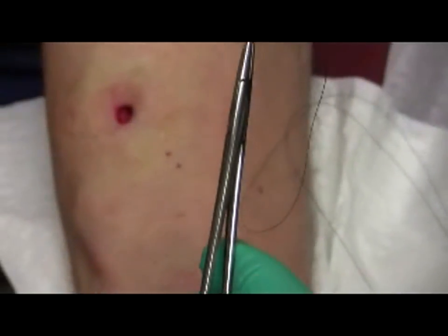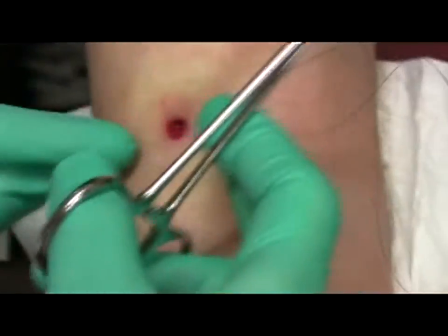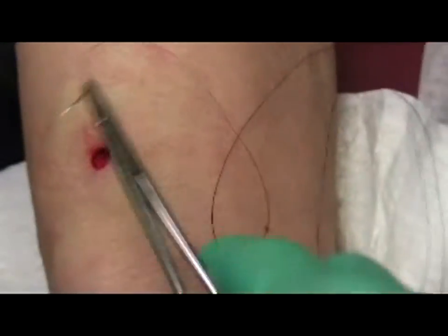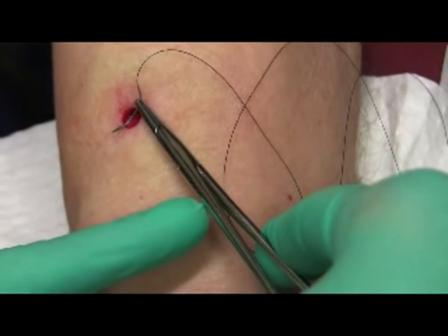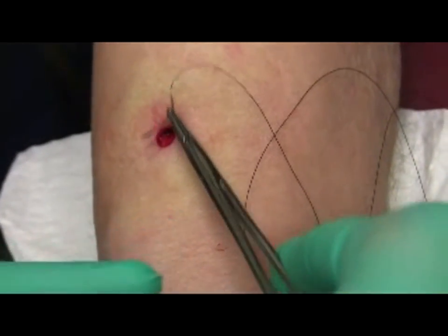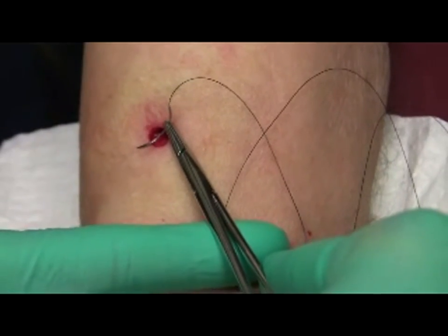For this wound, I have to decide which way I'm going to close it. There's no real natural direction here, so it's a little arbitrary. I'm going to do it this way. This is a six millimeter punch biopsy and you can put three stitches — one in the middle, one here, and one here. If it's an even number you divide it into thirds; if it's an odd number you put the middle stitch right in the middle.